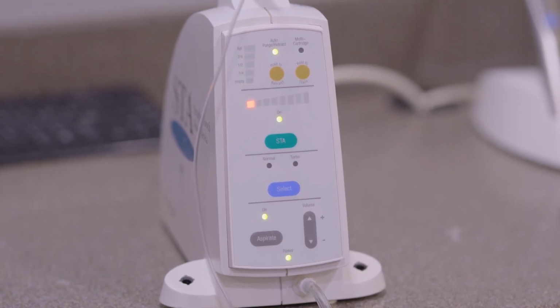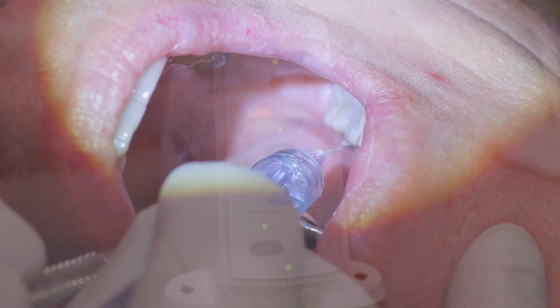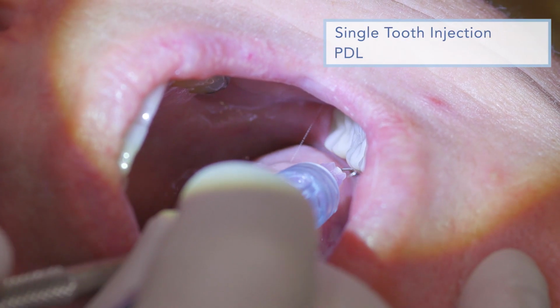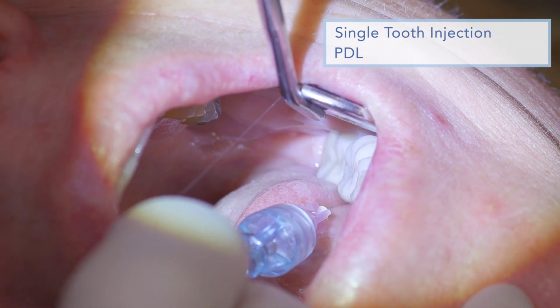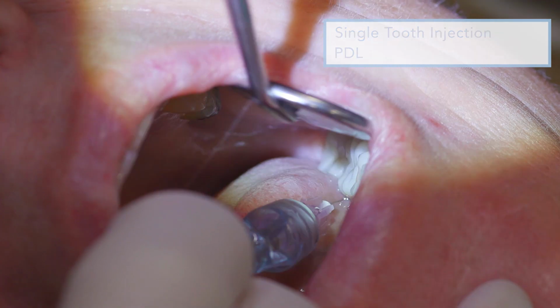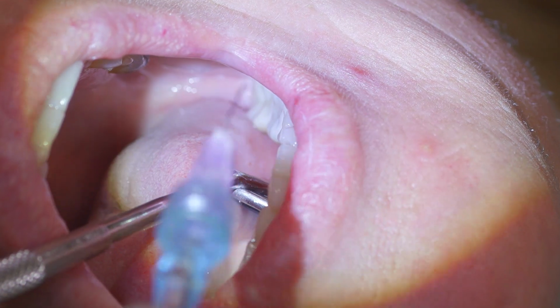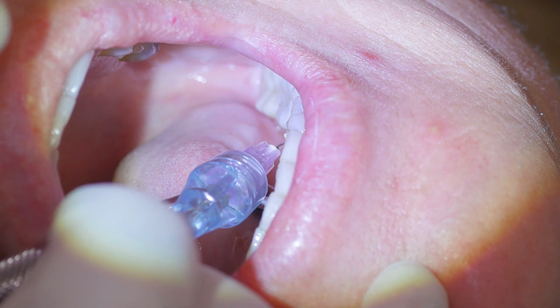Heather, I'm going to numb up your tooth right now. We're going to use this little device that's not going to do anything but numb up the tooth itself. Okay, so we're just going to rest this here. And now the machine automatically is anesthetizing you. Okay, and nothing came out of the needle, so we know it all went into the bone. Okay, one more time.